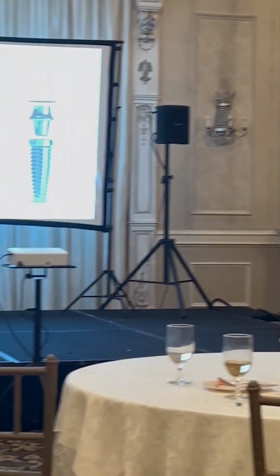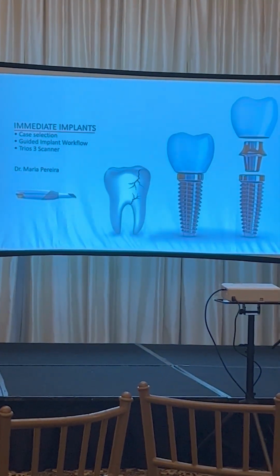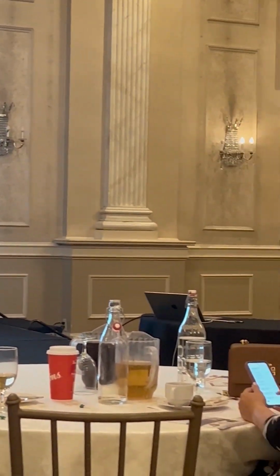Today my topic of discussion is on how I have incorporated immediate implants in my practice. I will be sharing a couple of cases that I initially started off with. I have a guided implant workflow and a Trios scanner with which I take impressions for the digital guide and for the crown.